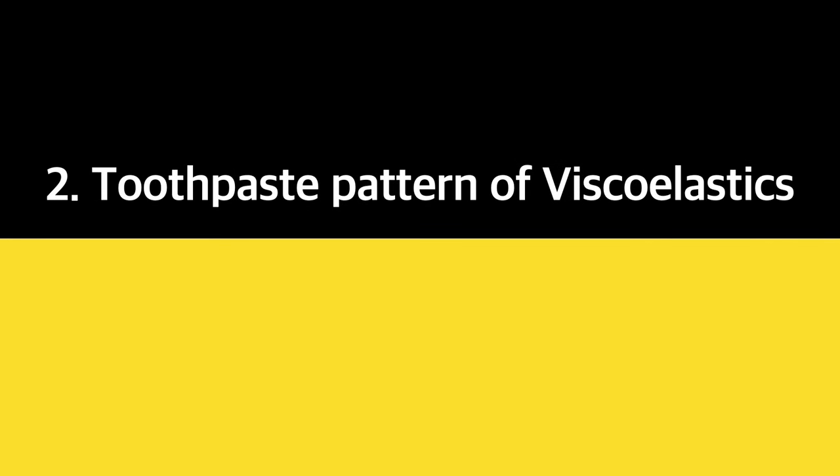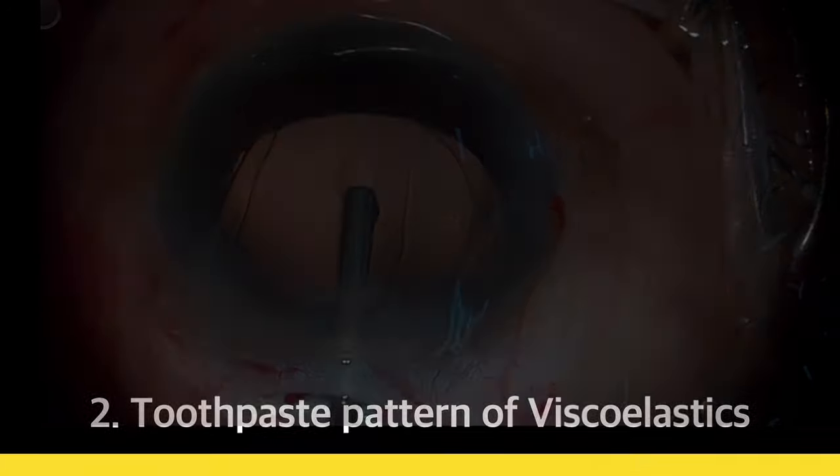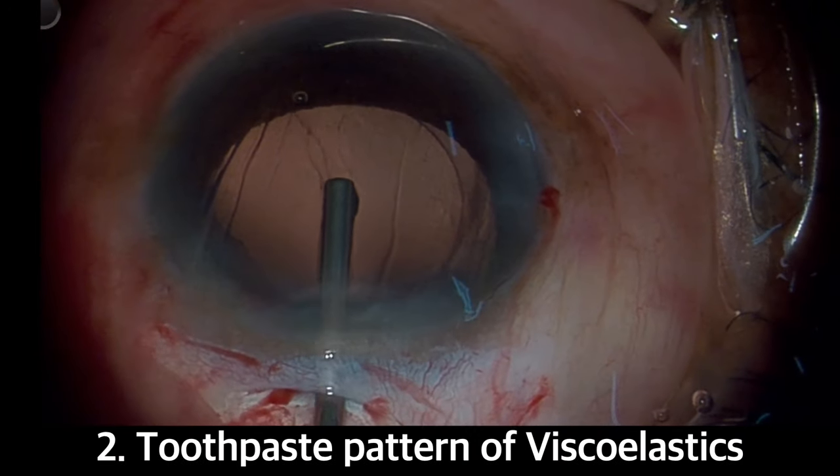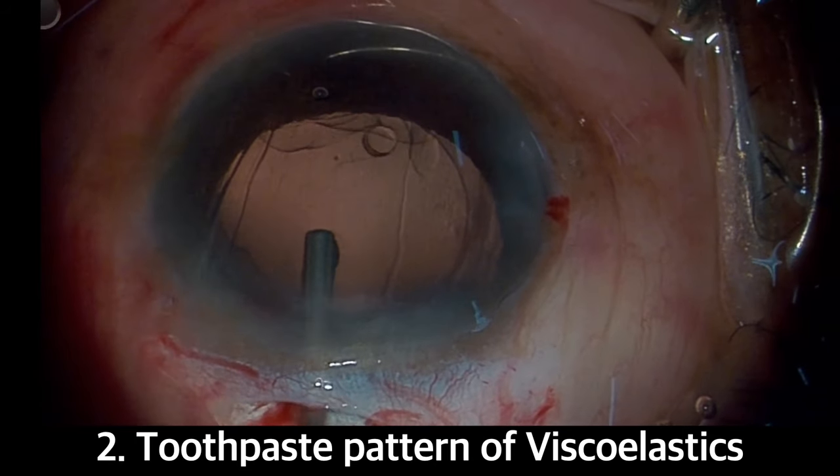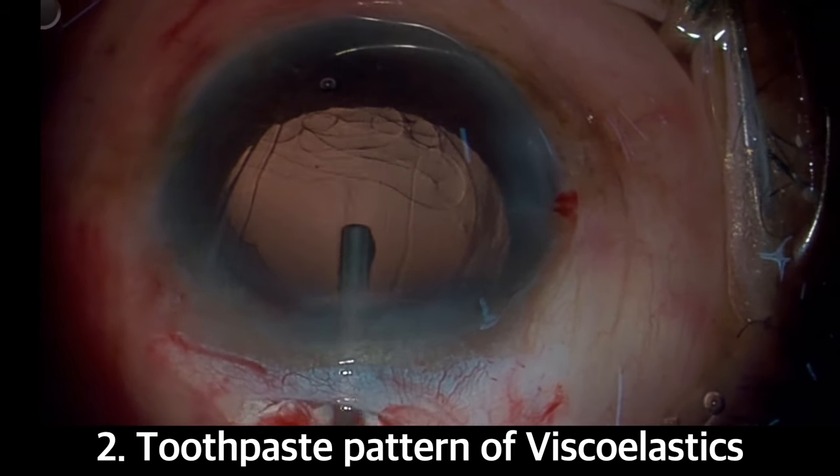Next, we have the toothpaste pattern of viscoelastics over the posterior capsule. As we inject the viscoelastic substance into the anterior chamber, it starts coming out from the cannula just like toothpaste coming out of its tube.